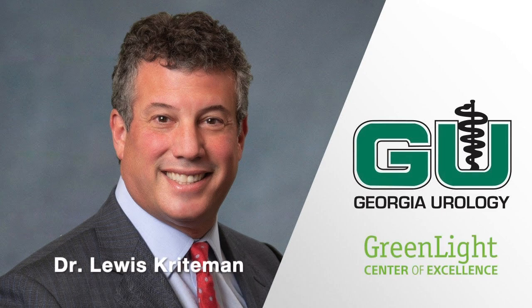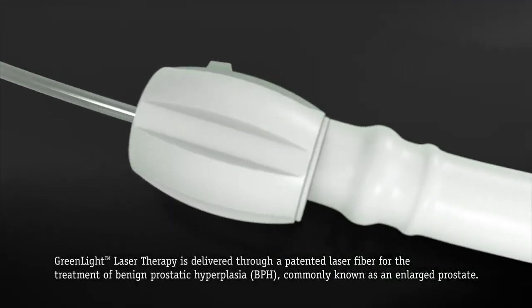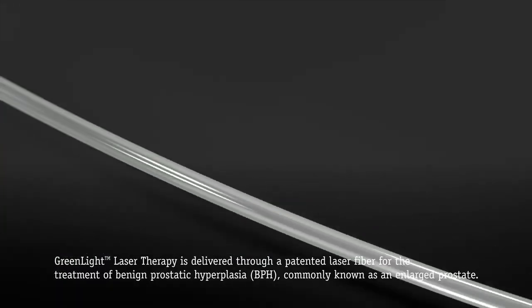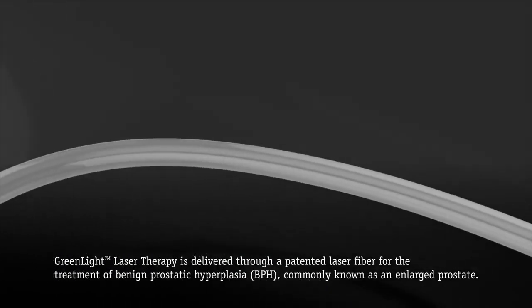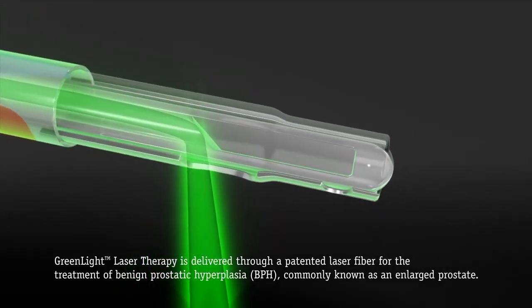This is Dr. Louis Kreitman with Georgia Urology, and I wanted to talk today a little bit about green light laser therapy for an enlarged prostate. Green light laser therapy has been around for over 20 years and is a very safe and effective way to remove prostate tissue and allow patients to empty their bladders much better.